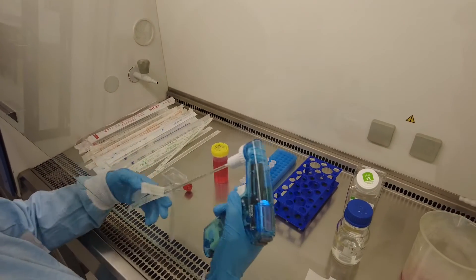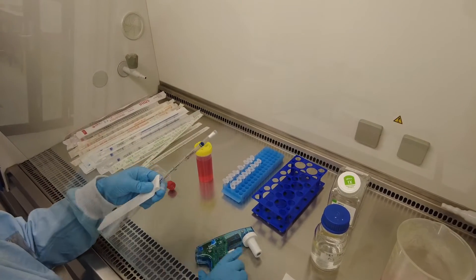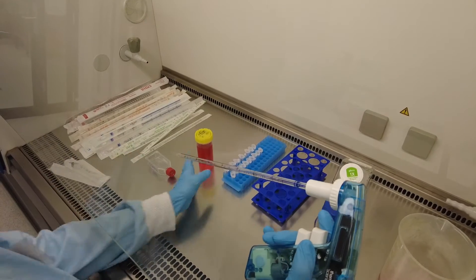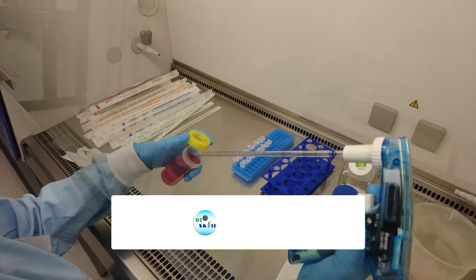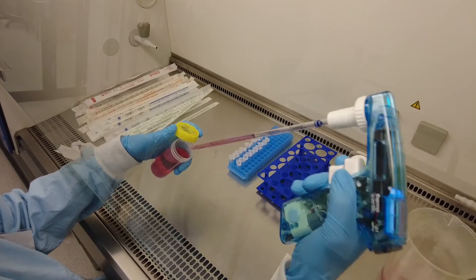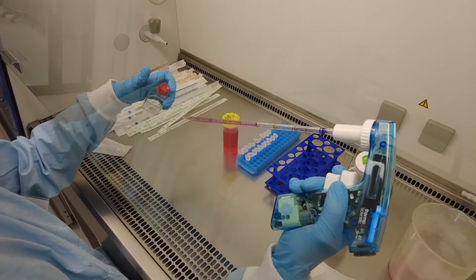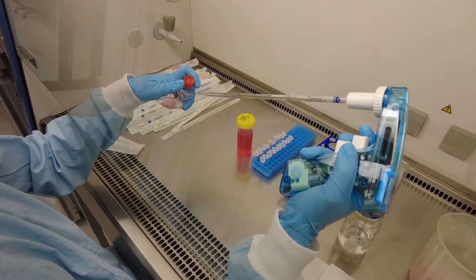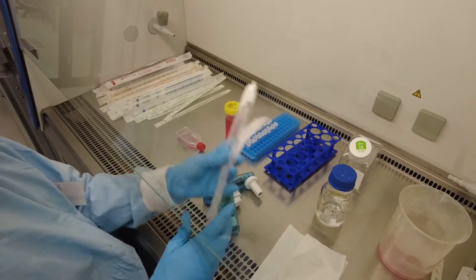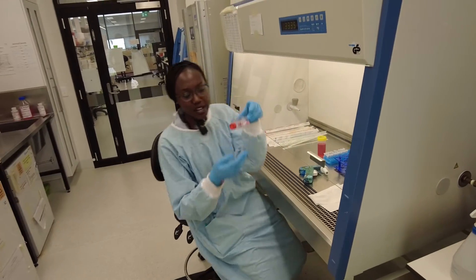Now we add fresh media — about 5 ml. And that's it. We're going to keep the cells growing and have a look under the microscope.